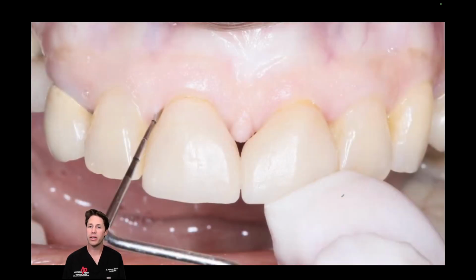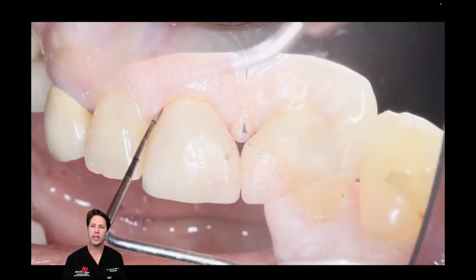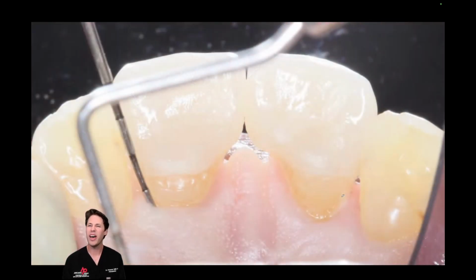Let me probe that area. Notice the firm pressure, the blanching that you're seeing, and the area probes twos and threes. So the area is resistant to probing, which would suggest osseous regeneration apical to that free gingival margin. But let's walk around that probe and look at the palatal aspect. Look at how healthy that tissue is with localized 2 and 3 millimeter probe depths. A great clinical outcome and good long-term stability. So we have improved the periodontal prognosis of this tooth.